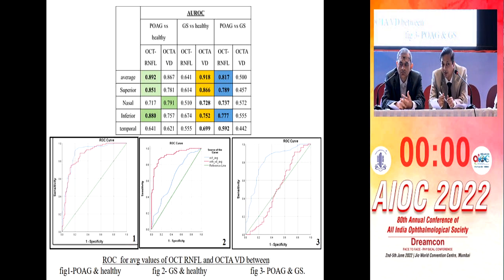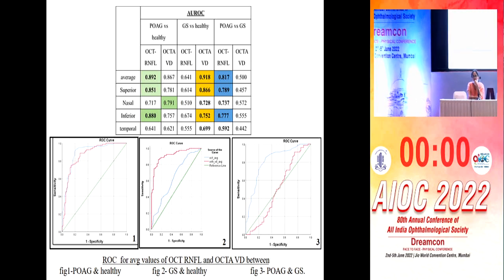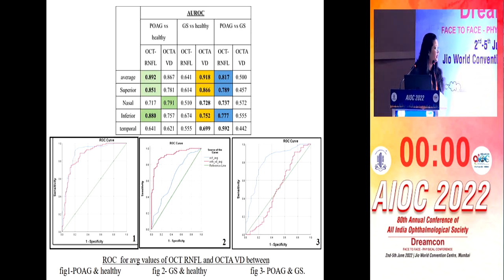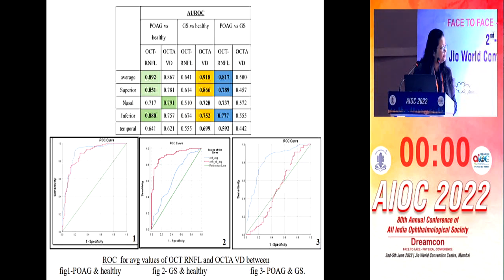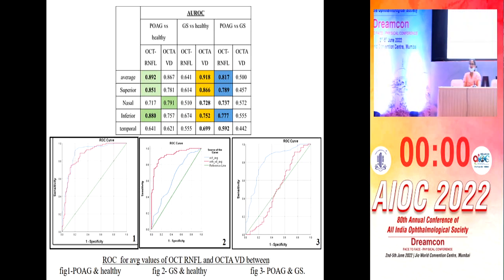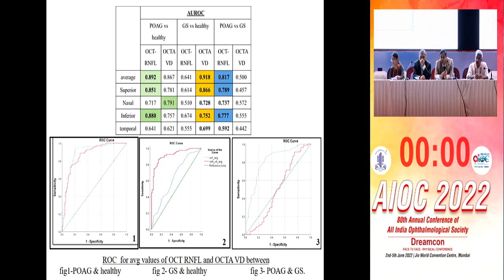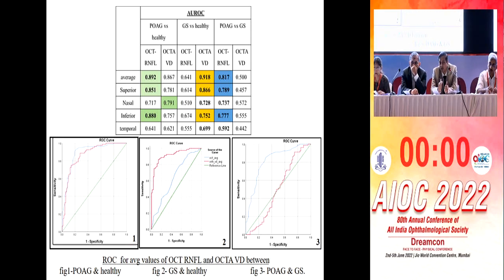Yes, so can you just? So that is what was our confusion, because when we compared it with others, like Yar Muhammad Ali's comparison, they found both of them to be significant. I'm not talking about that. Yeah, I understand. First of all, 0.9 is decent enough. Yes, but sir, I'm saying that the POAG AUROC curve is a little inferior compared to glaucoma suspect versus healthy.